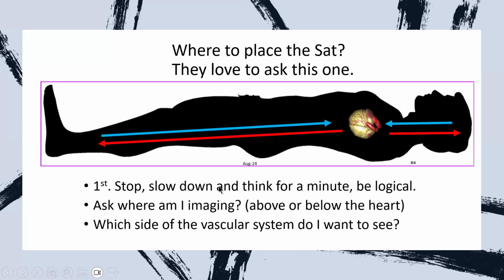So just be mindful. You have to stop and think for a second, okay? Am I above or below the heart? And which side do I want to see? And that's where you're going to put your sat pulse, okay?